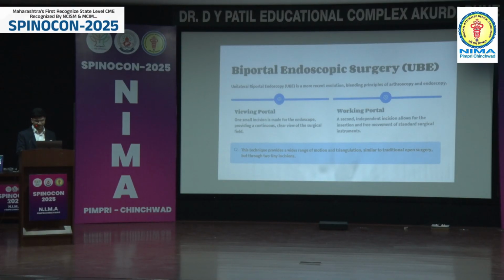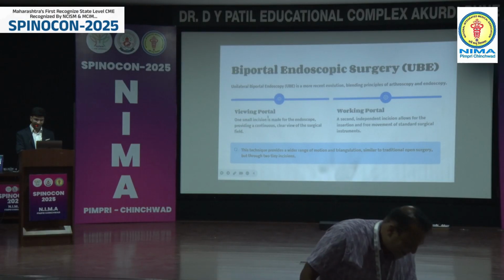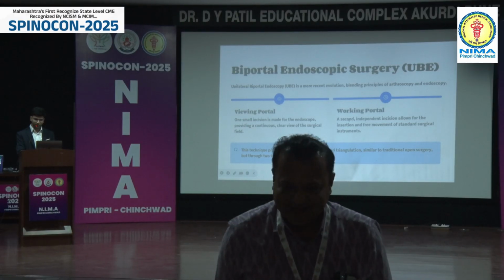And the most advanced technique of endoscopic spine surgery is biportal endoscopic spine surgery. Here 2 small incisions are taken on the back, one for the viewing portal, that is for the camera, and the other is for the instruments.